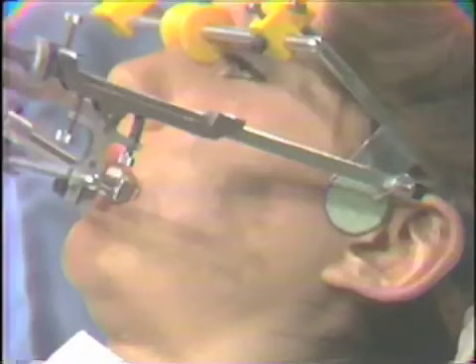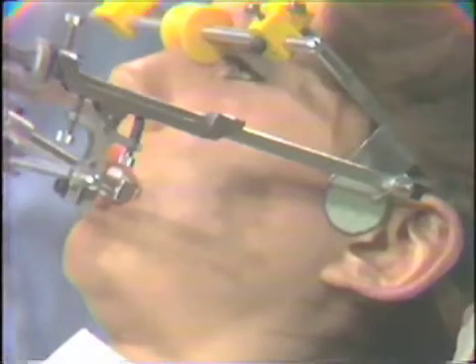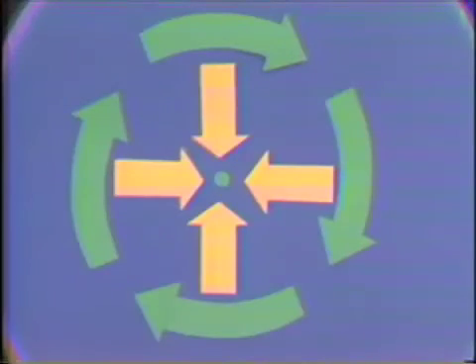Now, by observing the movement of the stylus against the grid, we can tell how we want to make the adjustments of the pointer on the sidearm. Let's refer to this grid, or this graphic. You can see here that we're going to be on an arc around the true hinge axis. By watching the way the pointer moves, by watching the arc, we move towards the center of the arc, and eventually we'll end up at the true hinge axis. And this is a graphic illustrating how we adjust the stylus towards the true hinge axis.